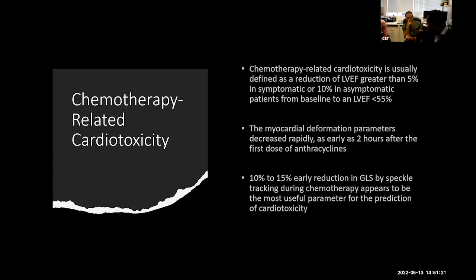So in our practice, all of them actually get GLS. It takes about an extra minute or two once you get quite used to measuring them. But we also start doing, quite routinely, 3D or 4D LVEF as part of the practice.